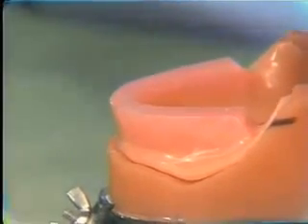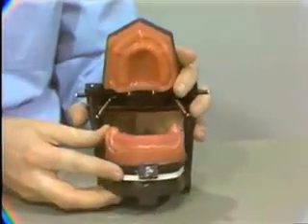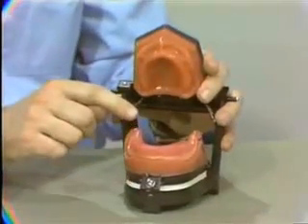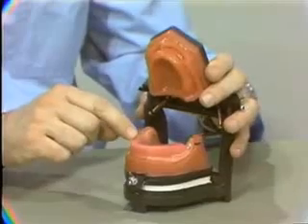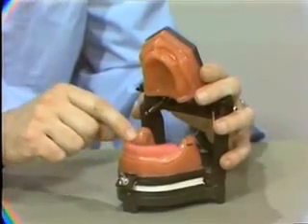So the first step, without reviewing or without demonstrating, we've done this enough by now, is to establish the wax occlusal bite rim on the lower. Now, this is hard. This is finished. This is not softened again in the procedure.